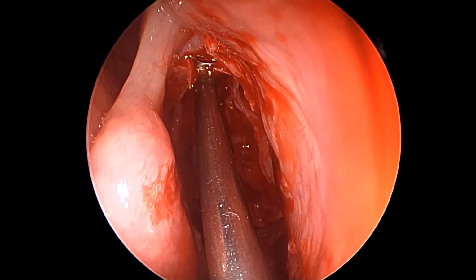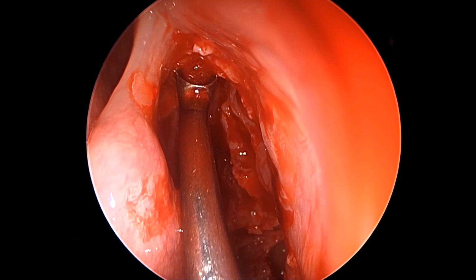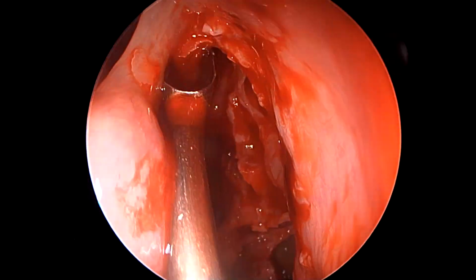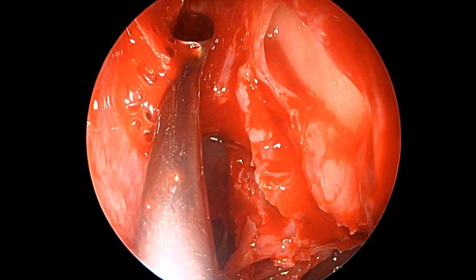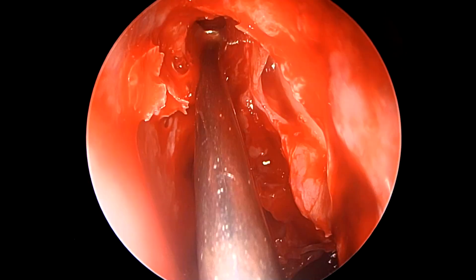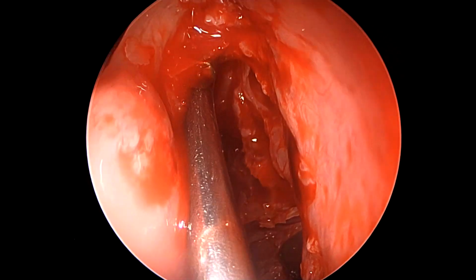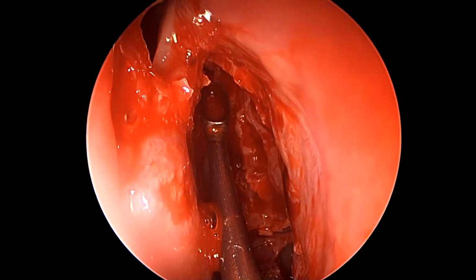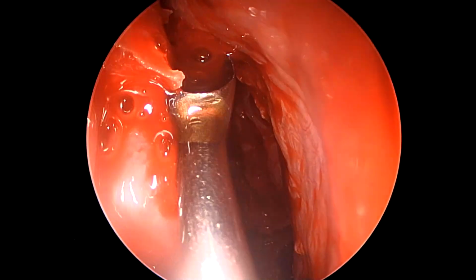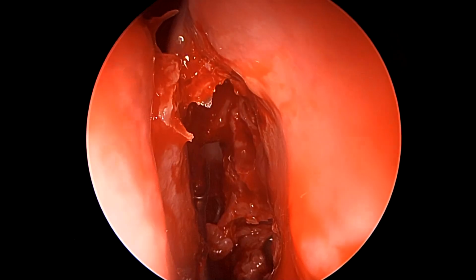So now, once a basic ethmoidectomy cavity has been completed, the posterior ethmoid has been opened, the sphenoid has been opened, the maxilla has been opened, we divert our attention towards the frontal sinus, and here we are taking our curette and trying to move it inside the frontal sinus and back fracturing the tier of cells that comprise the frontal recess in this case.